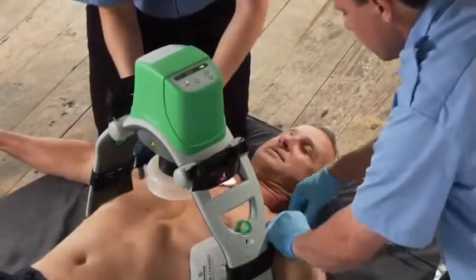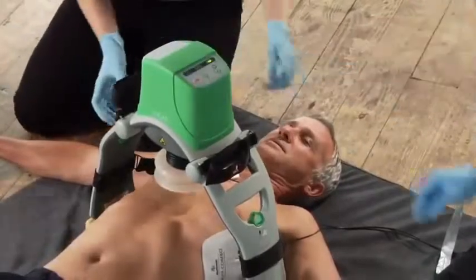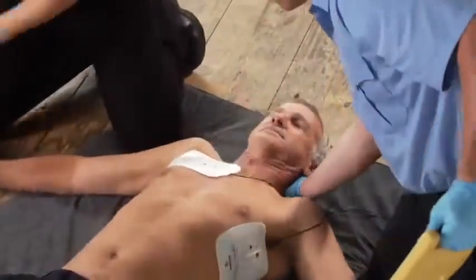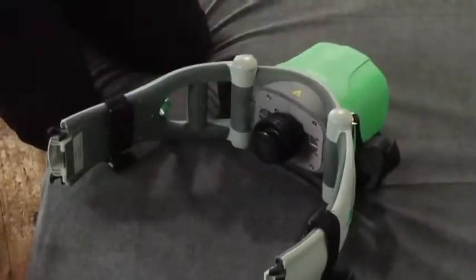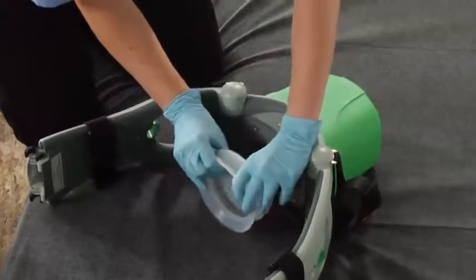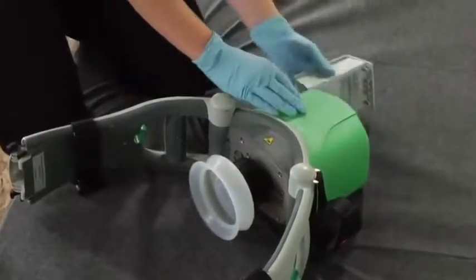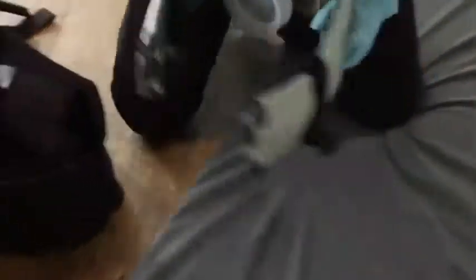To remove Lucas, detach the stabilization strap, push the on-off button for a full second to turn it off, disconnect the upper part from the back plate with the release rings, and remove the back plate if the patient's condition allows. Clean Lucas as necessary before putting it back in the bag — do not immerse Lucas in liquid as it can be damaged if liquid enters the hood. To change the suction cup, peel it off and dispose of it as contaminated medical waste, then put the new one on and make sure it's fully seated. Replace the battery with a fully charged one, then put Lucas and the stabilization strap back in the bag.